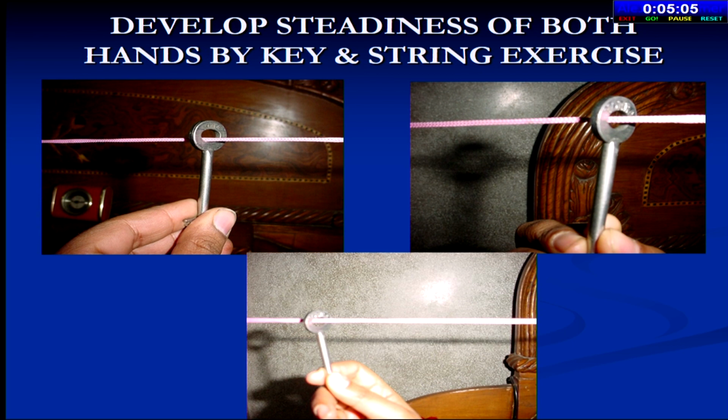And these things should be done well before you are going to do Phaco. This doesn't require money, it doesn't require anything. The only thing I found is that trainees are lethargic. You tell them these things, they just laugh it away and go. We'll go see the movie, but don't do this exercise. I give them aluminum foil: make the rexis marks on a foil, tighten it on a wide bottle. It makes beautiful rexes. Once you do 50 rexes like this on a foil, your fingers will know where they are moving. And put red butter paper under that foil, so you learn the red reflex also. So learn the rexes outside the eye.